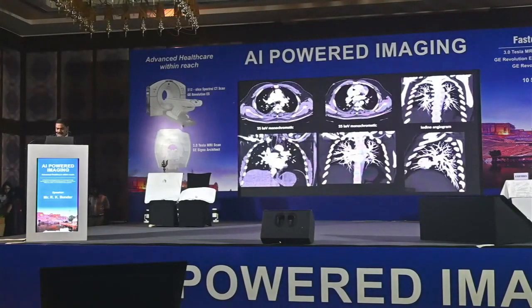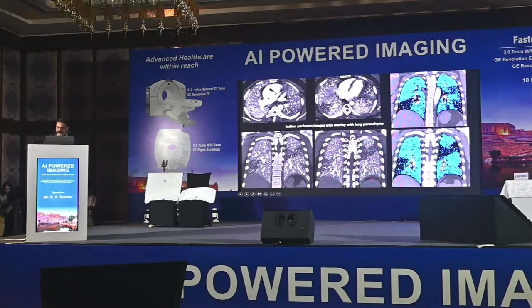Here is a patient who had 7 days of treatment and a follow-up scan, and we were able to pick up those areas where there is no perfusion. You can see them as black areas, and the normally perfused areas are in blue. That's because of the fibrosed lung, which is not responding. Right? So whether to continue the treatment or happily discharge the patient if the patient is functionally doing well, this decision can be made from spectral imaging.